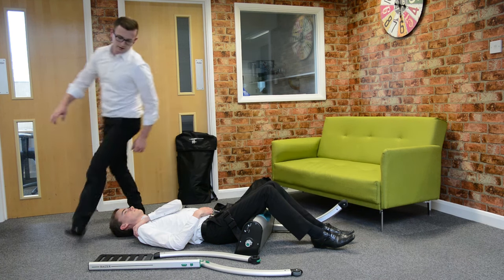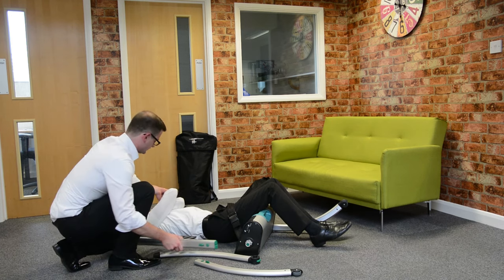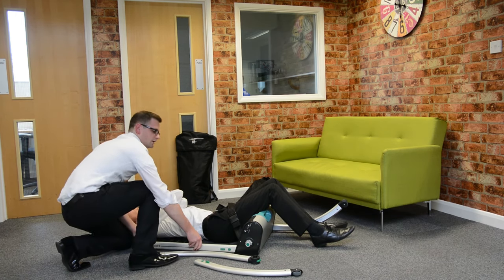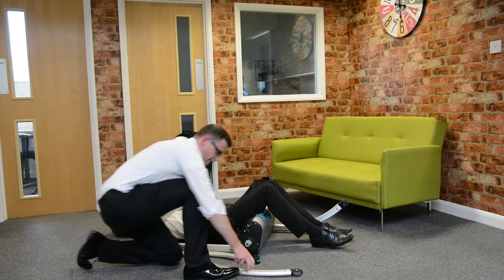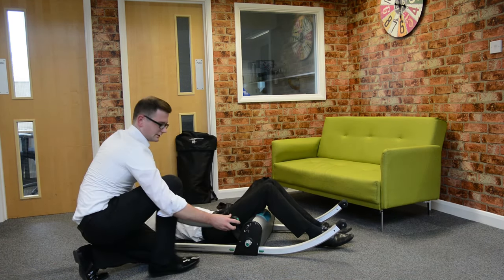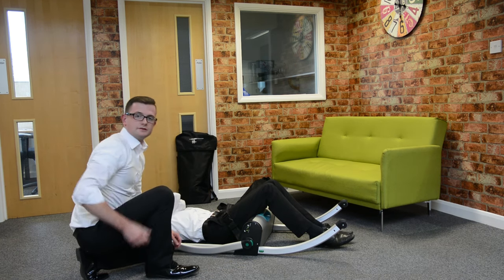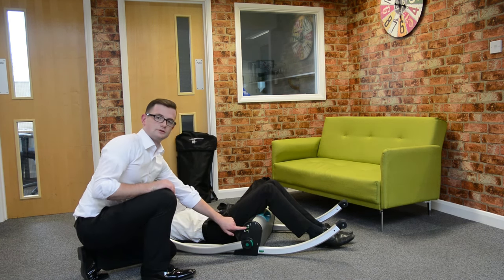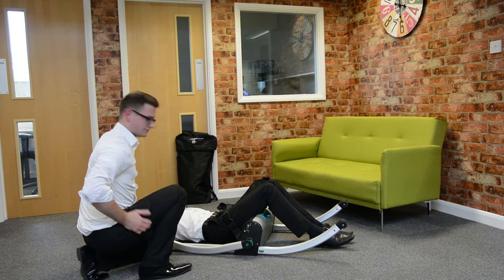Then repeat the final lifting arm. When everything's in place, there is a beep and the light underneath the tip comes on, so we know everything is correctly assembled.